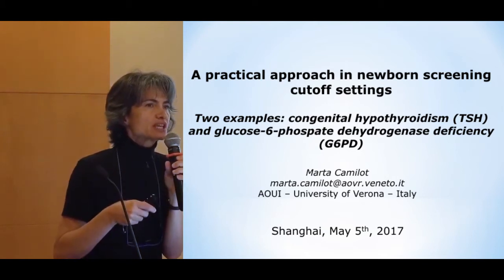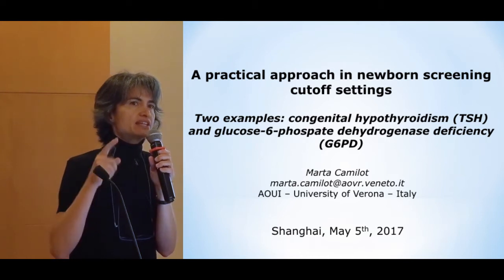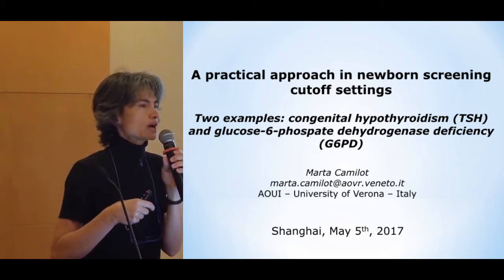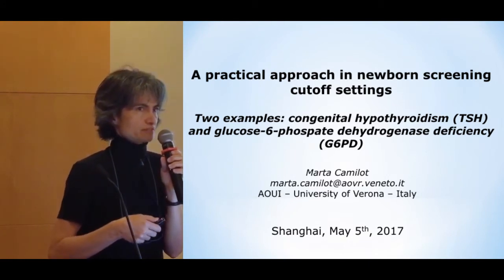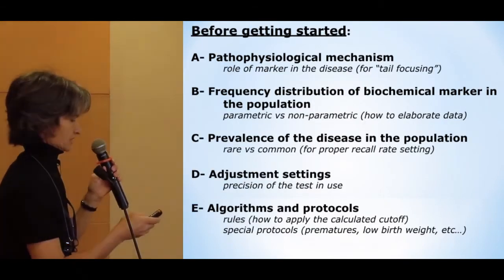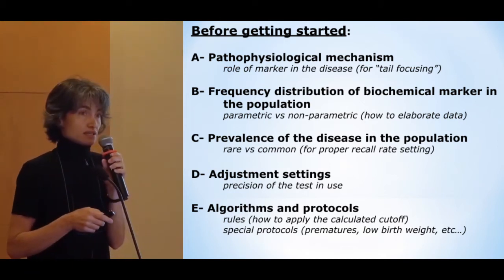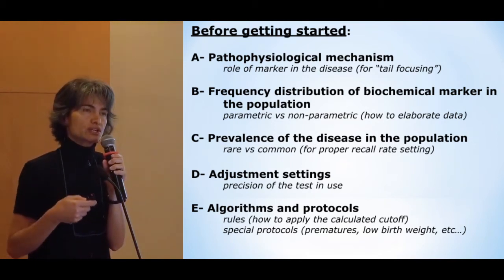And your mission is to identify potentially affected newborns. And the evaluation of your cutoff is the main tool that allows you to fulfill the requirement of identifying affected babies. Okay? So let's start. Okay, so right before setting the cutoff, we have to make some considerations.